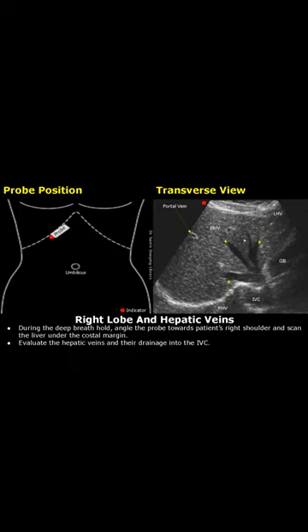You will be able to see all three hepatic veins. This is the left hepatic vein — it will always be in the right half of the image. This is the middle hepatic vein. And this is the right hepatic vein, which will always be in the left half of the image.